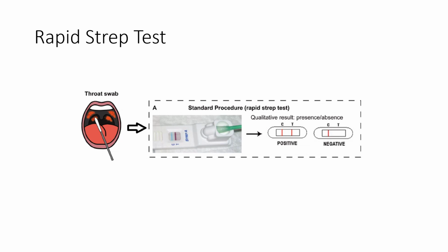Notice that we have a control line to indicate that yes, the antibodies are moving, that there are antibodies in there, that the antibodies do react. That's very important. In any test, you've got to have a control. So the antibodies would move and indicate that yes, this test is working properly.